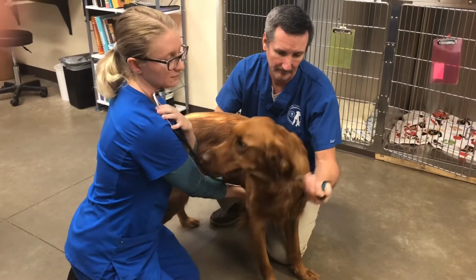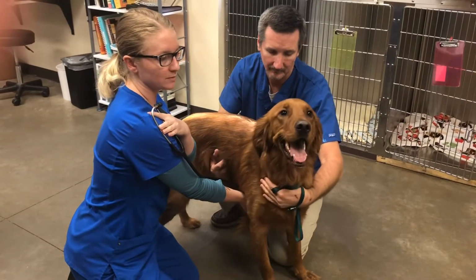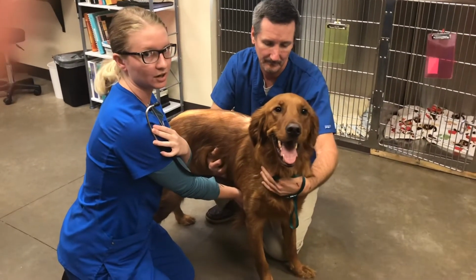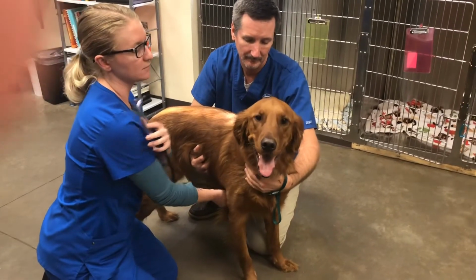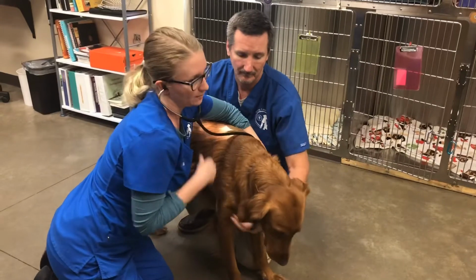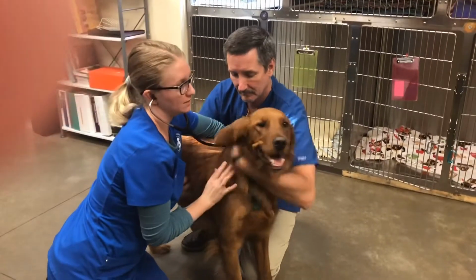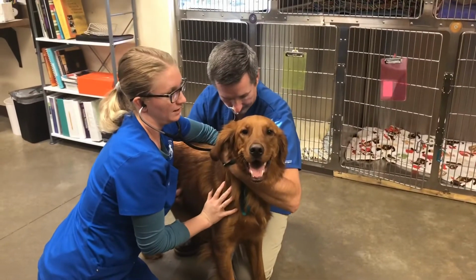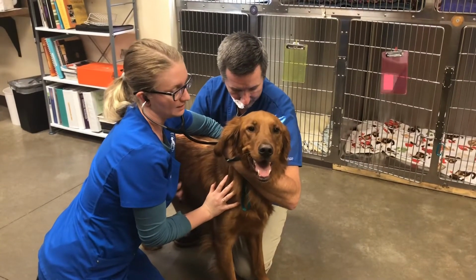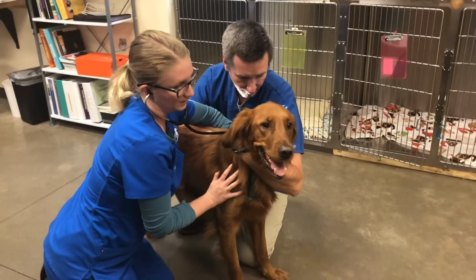So his heart beat 15 times in 10 seconds. I'm keeping an eye on the clock over here. If you multiply that by 6, then you get a heart rate of 90 BPM, or 90 beats per minute. Take a listen to the other side. I'm also listening for any abnormalities, like I mentioned earlier, any sounds that would indicate a heart murmur or any irregular intervals that could indicate an arrhythmia. I'm not hearing any of that with him.